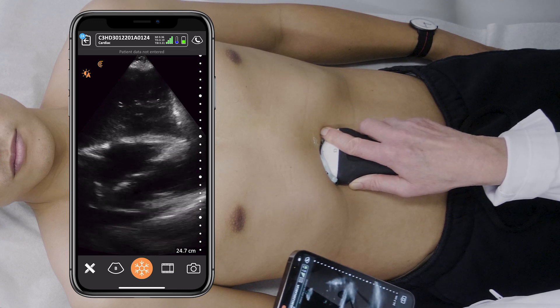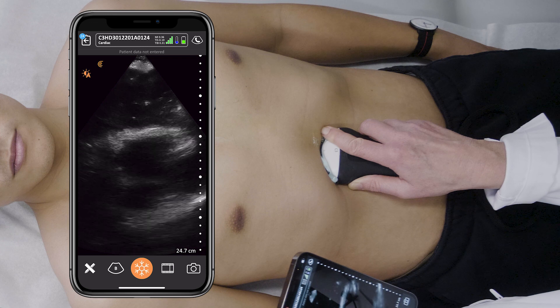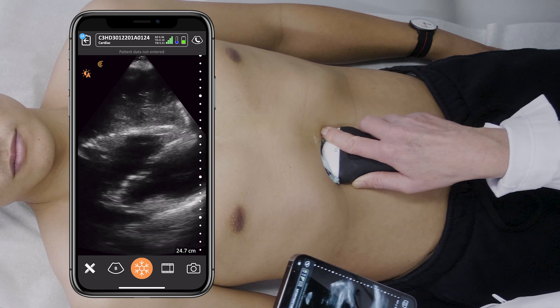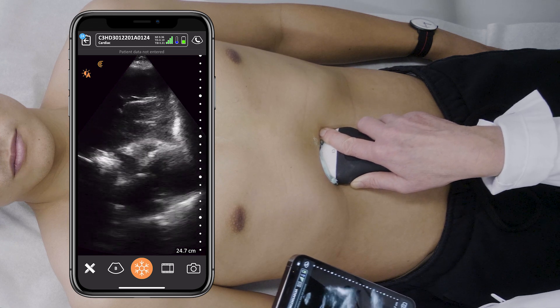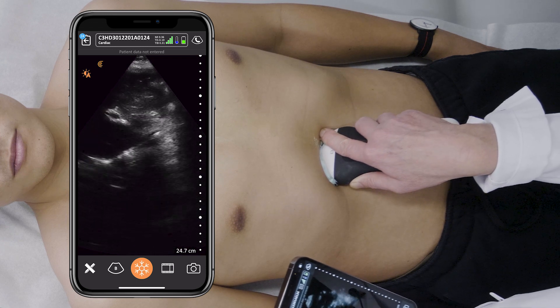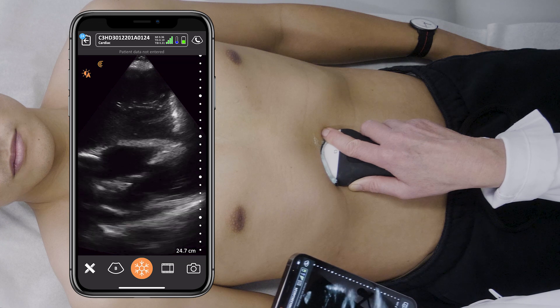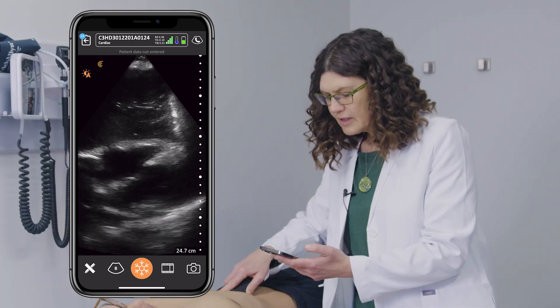Here I'm doing an anterior sweep, and then I'm sweeping posteriorly through the heart. This concludes the sub-xiphoid view of the heart.